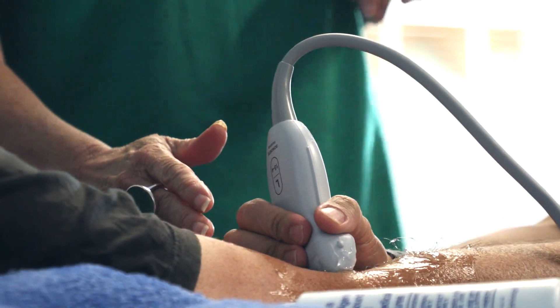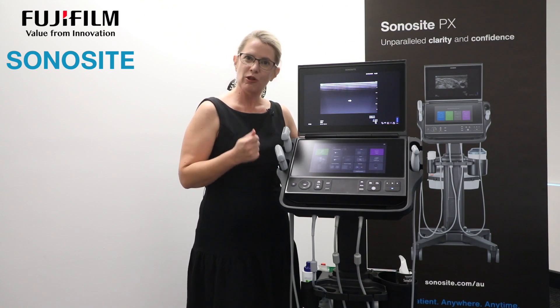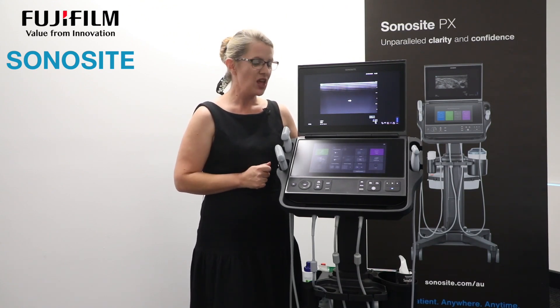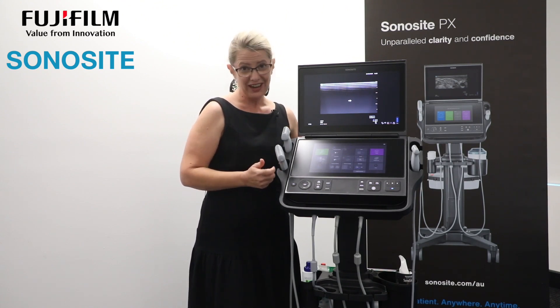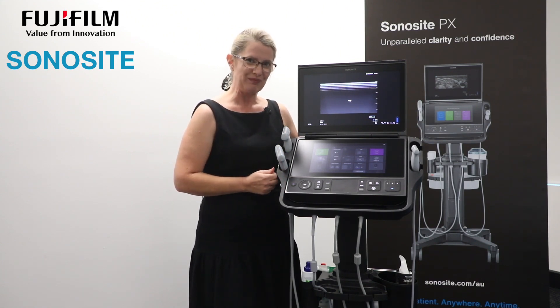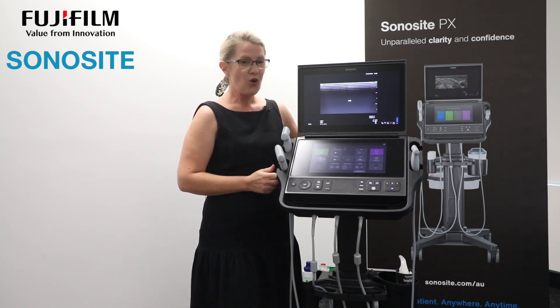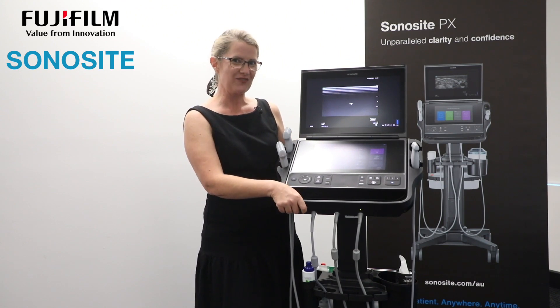What our clinicians are loving about the Sonosite PX is that their feedback has been taken on board to help them deliver better care to their patients at the point of care setting — through workflow efficiencies, image clarity, and the system's adaptability. It's really ticking boxes for them, and I look forward to being able to show this to you, or having my team members show this product to you in your own environment.